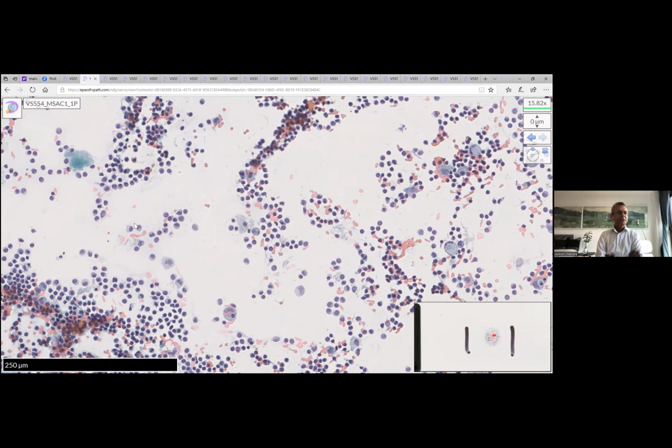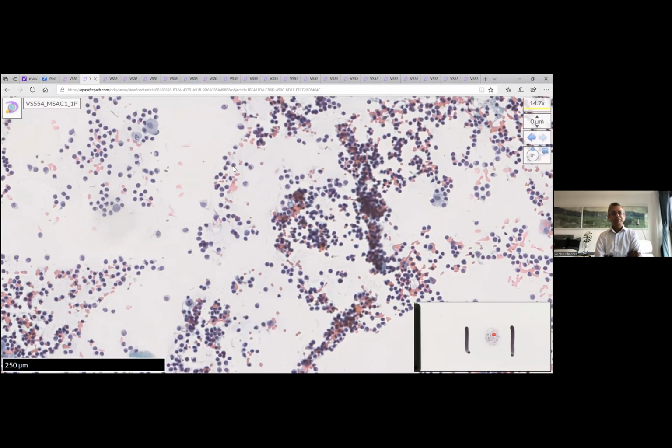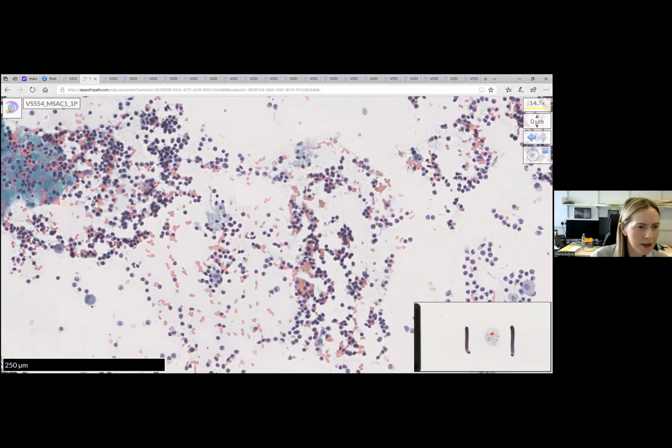Benign, malignant, any specific type of effusion, lymphocytic. Okay. Okay, benign, abundant lymphocytes, macrophages, benign mesothelial cells, maybe saying lymphocytic effusion. Okay, so Maria, what's the answer? Yeah, absolutely. Everyone seems to be going for essentially, lymphocytic.